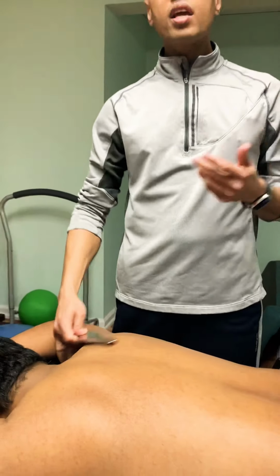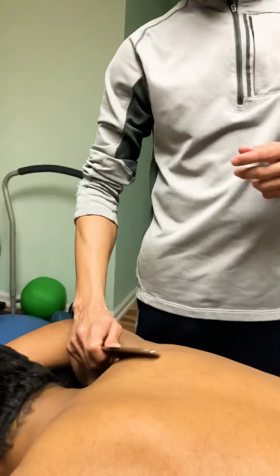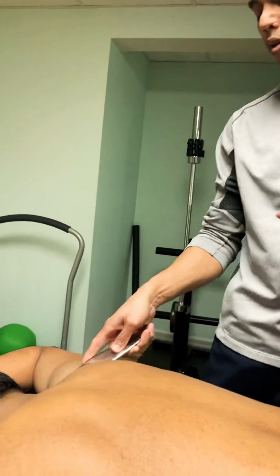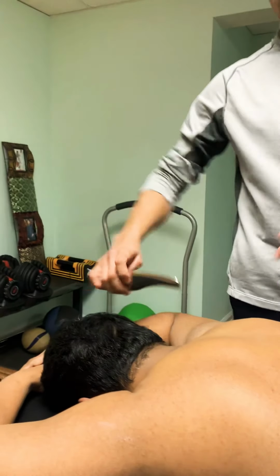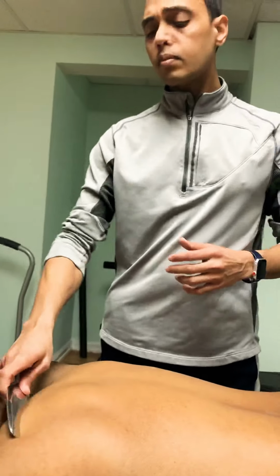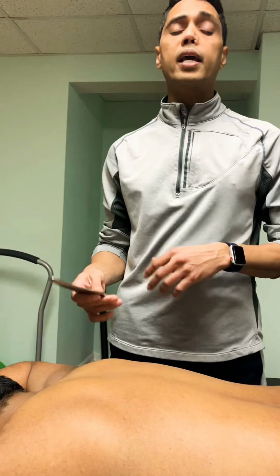So what I'm demonstrating are the different strokes you could use. I could go at a 20 to 30 degree angle and go in different directions because the goal is to cover the fascia in different directions. I would typically do this on patients with neck pain. If the pain is on the right, I would stay away from it first and do it on the left to correct mobility restrictions, all based on the assessment. I just want you to get an idea.